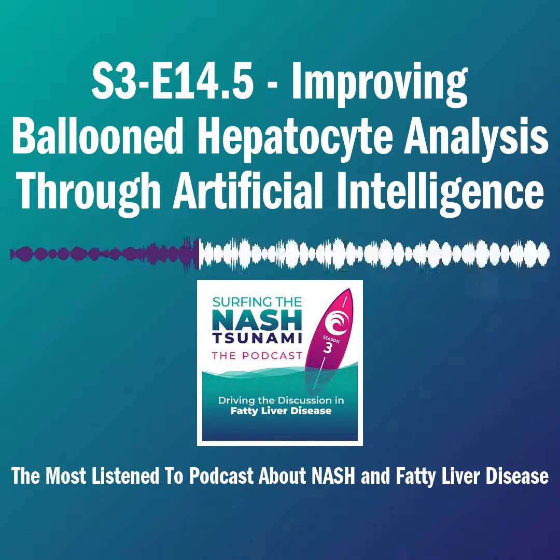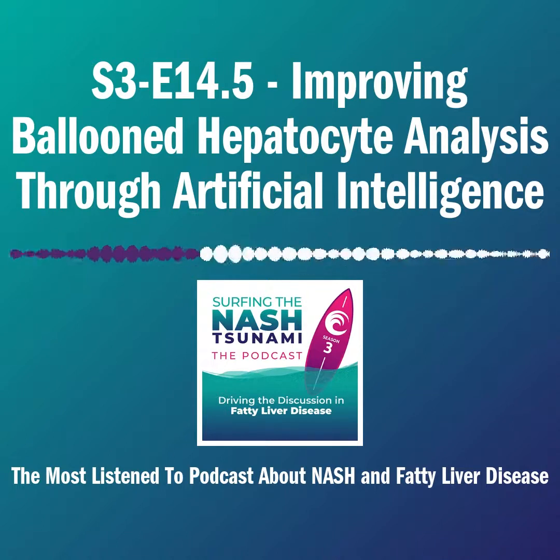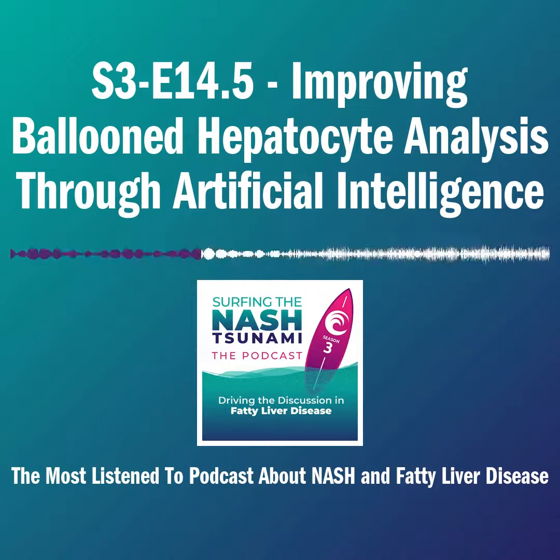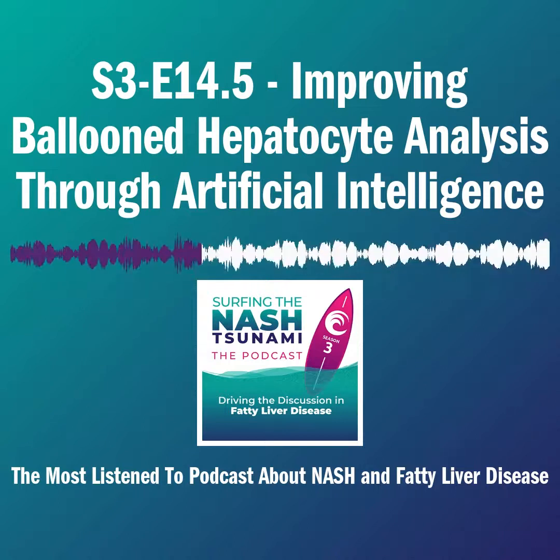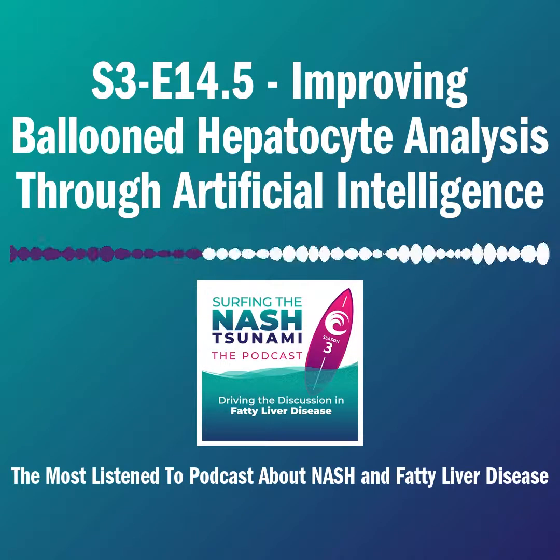So if you want to be absolutely sure that there isn't a single ballooned cell anywhere, you turn it one way. On the other hand, if you want to identify cells that the majority of pathologists would agree on, or in English law we have the concept of the man on the Clapham omnibus, which is basically the man in the street, then you turn it the other way and dial your sensitivity and specificity in that direction.